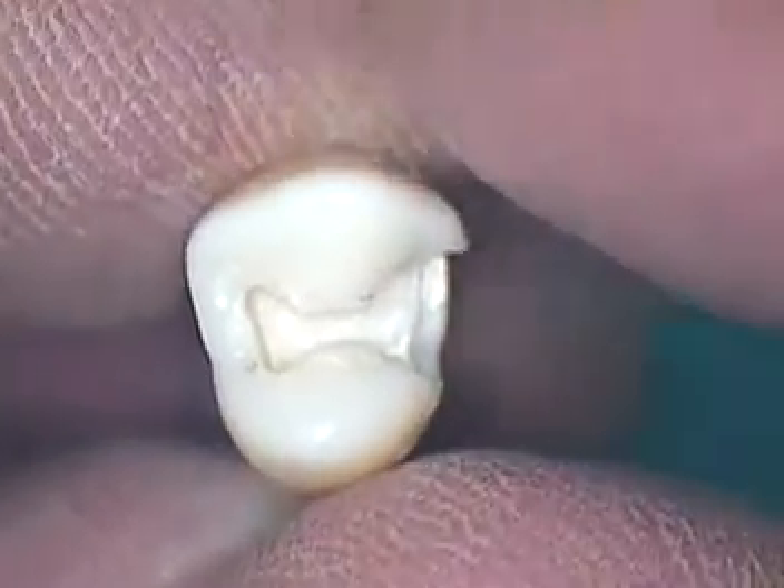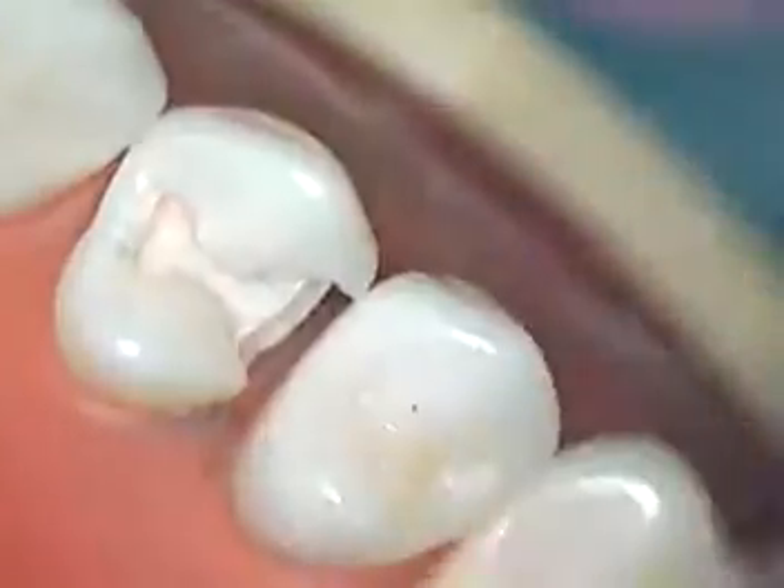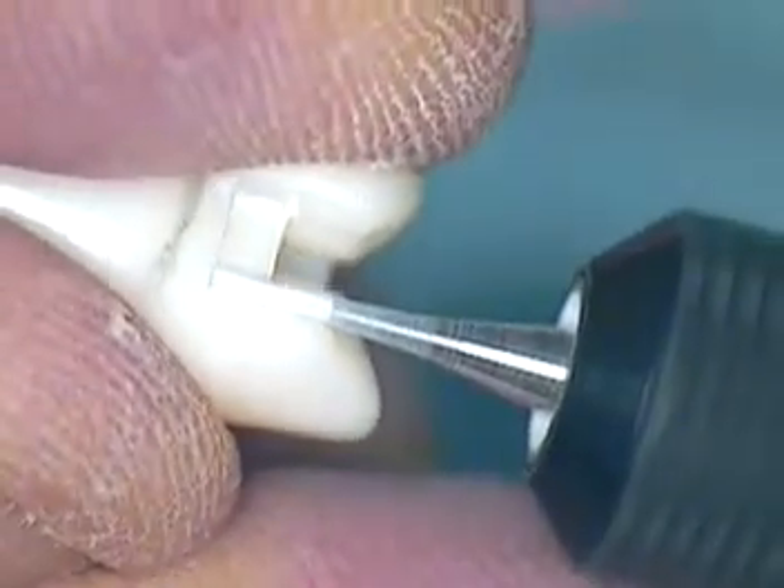In class, what you'll have to do is put it on the typodont and make sure that you have a lot of clearance in between it to place your matrix band. So I'm going to do that now — I'm going to take the typodont and just take a look and see where we are. Looking straight down, I notice I didn't break contact at that point — that's the point where the S contour is. So I'm going to take my handpiece and just do a little reduction facing the distal, just to open up that contact a little bit. Too tight — no good. You can't clean it. In the mouth, you may have to prep it a little bit more toward the buccal.